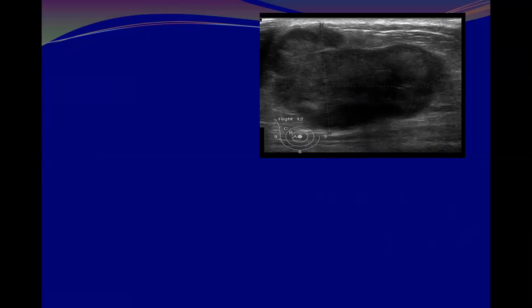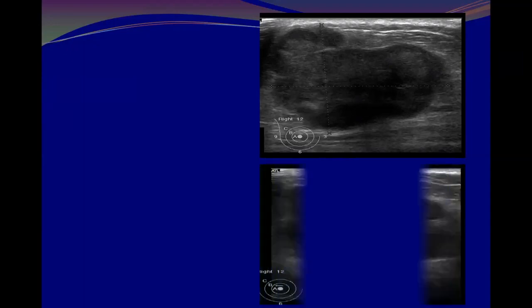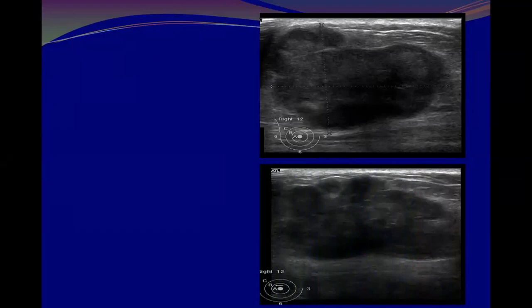So I expect you to ask me for more images. Yes, more images and the history of the patient, before deciding. I ask you, is it a fibroadenoma or cancer? Definitely from a static image, last time we said a single image is difficult to decide. Yes, excellent that you mentioned these lesions.